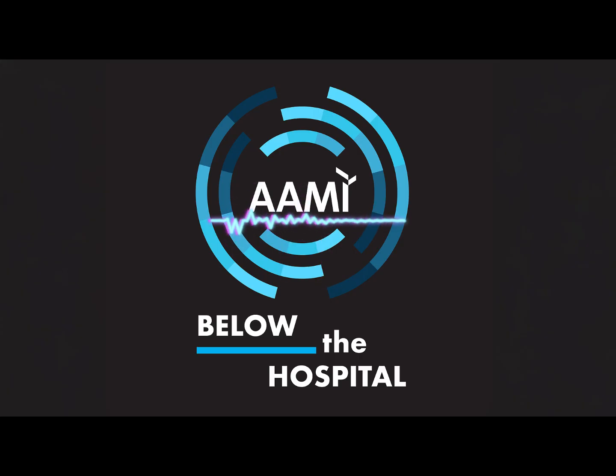Well, let's just hop right on into it. Now, let's talk about the role of guidance documents. So, what role do guidance documents, AAMI or otherwise, play in sterile processing? That's a great question, Garland. First and foremost, they're a statement of consensus that establishes technical specifications and provides a common language in the field that's being standardized. So it helps to set what should be occurring and orients everybody to common terminology, so everybody is speaking and meaning the same things when they talk about sterile processing. They're also intended to provide a minimum essential threshold for effectiveness in that particular practice. So they set kind of the baseline for what you should be doing to be effective in sterile processing.